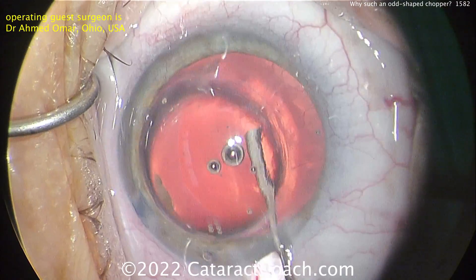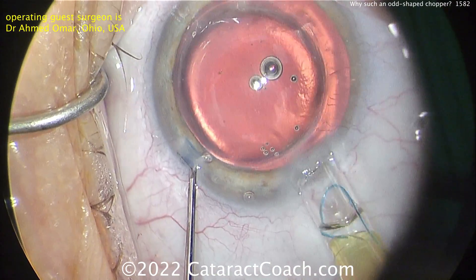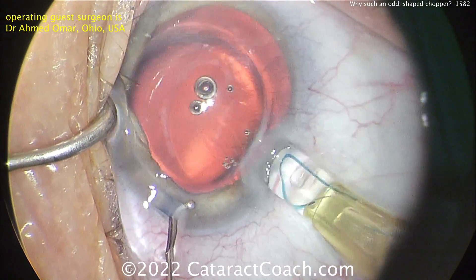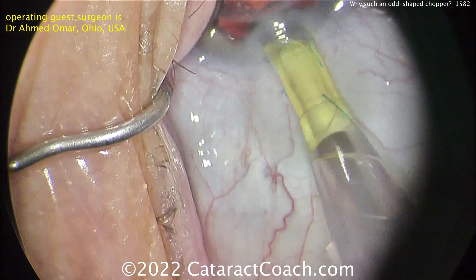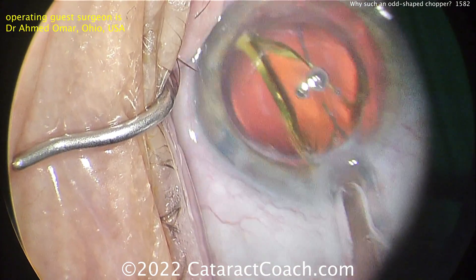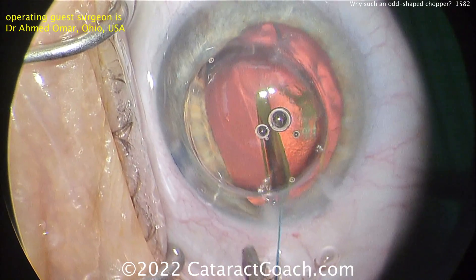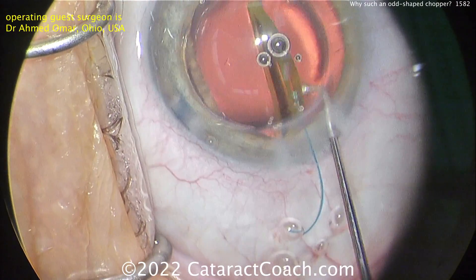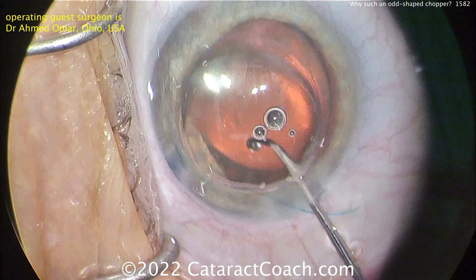Also keep in mind, if you are doing surgery on a patient with a cornea transplant, you need to avoid damaging the endothelium even more — and you can definitely damage it. These patients with the transplant already have a lower endothelial cell count, so you want to be very cautious. Use plenty of dispersive viscoelastic to protect that cornea, and recoat it if you need to. Try to operate away from that cornea — operate more in the bag. Here comes the lens; it looks really distorted as it goes in. Make sure you have the correct orientation. Looks great — this patient's going to have a really nice outcome.